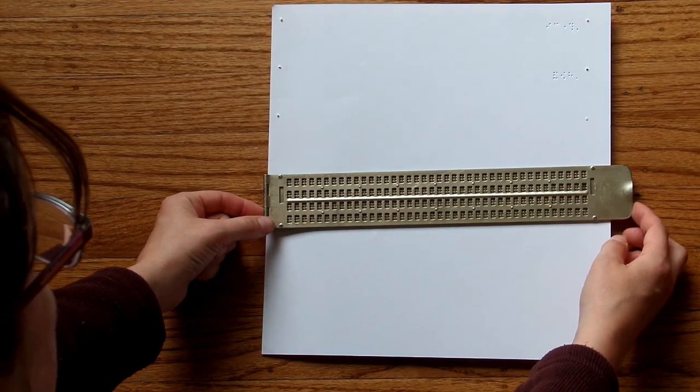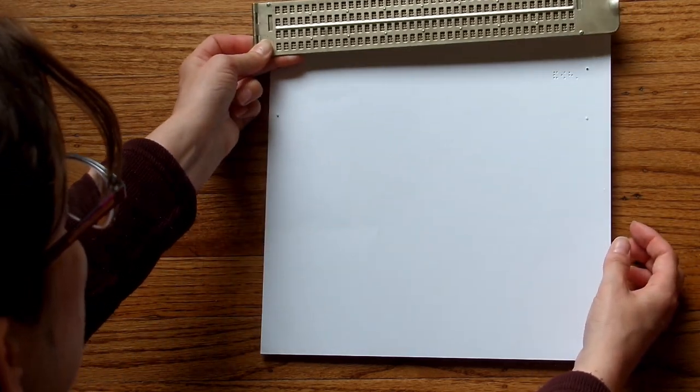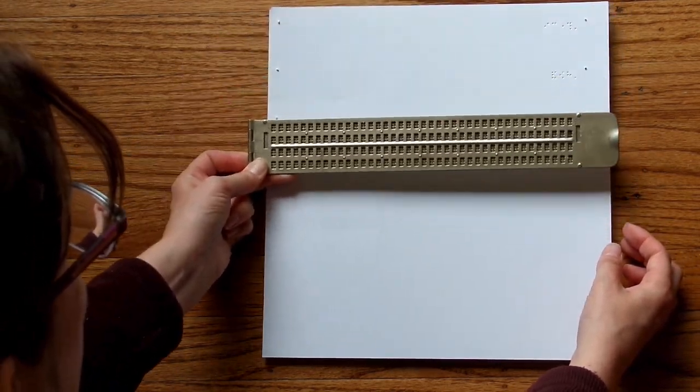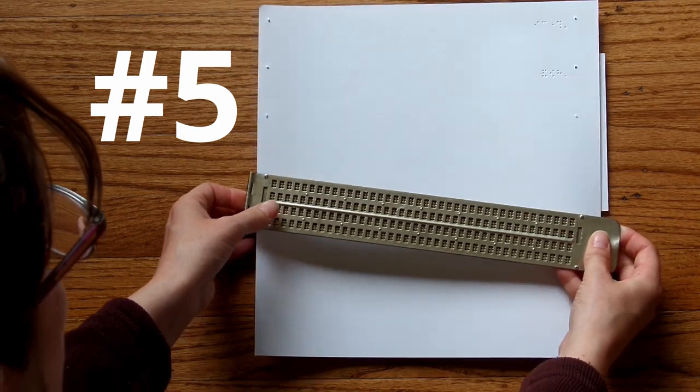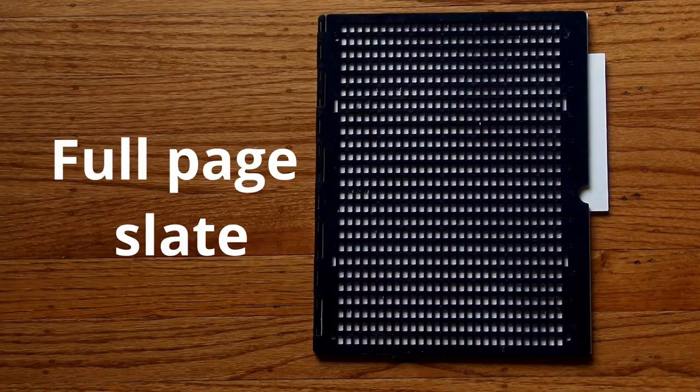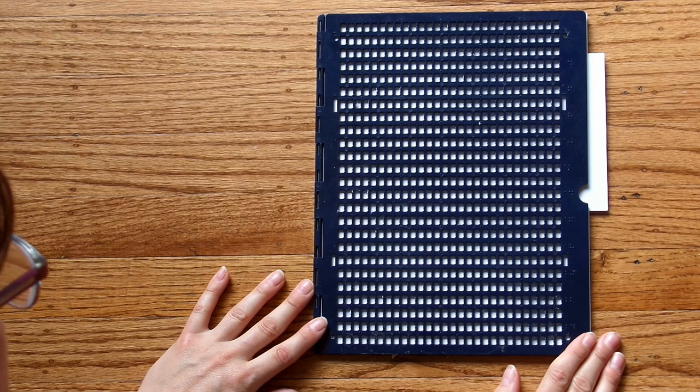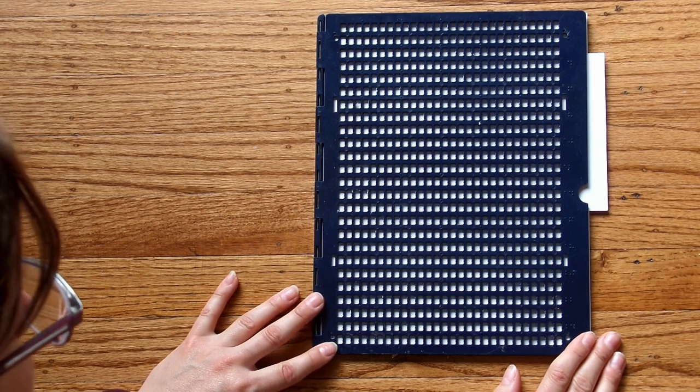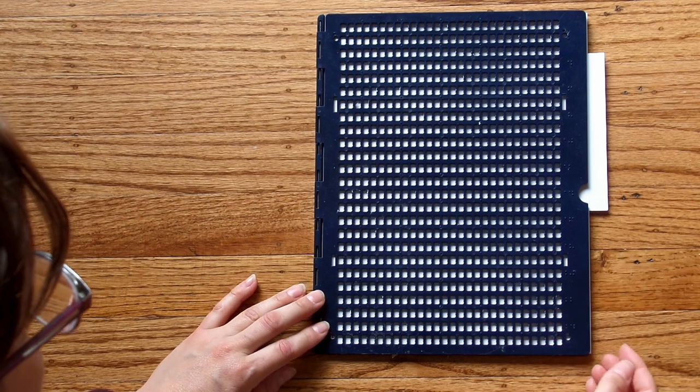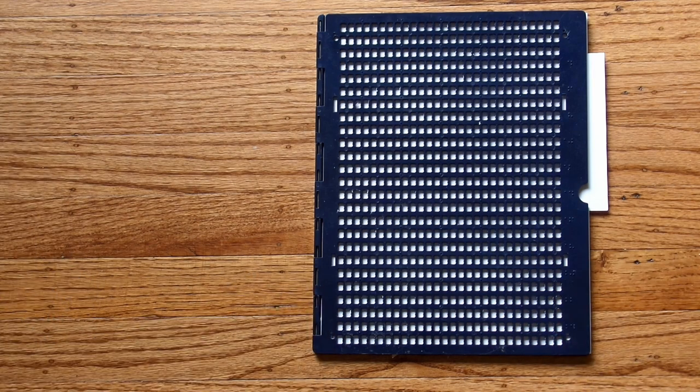So do you remember this metal pocket slate I was showing you, where you have to move it every four lines to move down the paper? So let me show you a full page slate, which makes this super enjoyable. This slate fits an eight and a half by eleven sheet of paper, but you can also get the ones that fit braille size paper. And you just pop the page in there, and then you can write your letter to your pen pal without having to move the slate down.